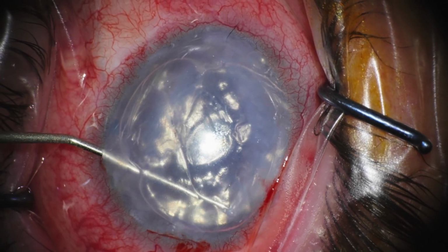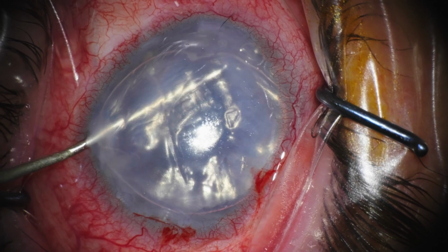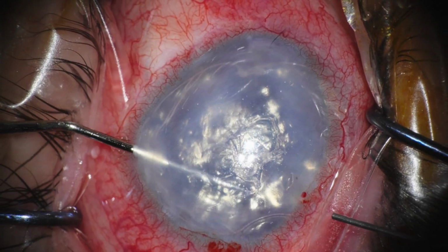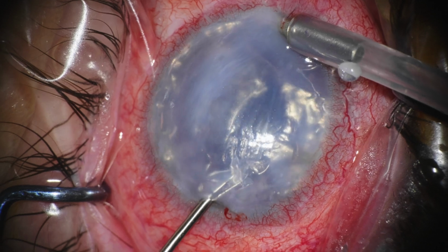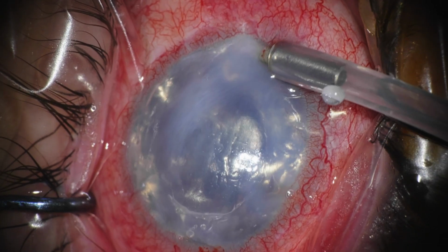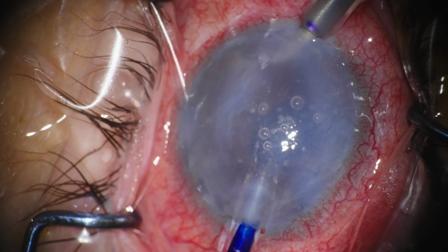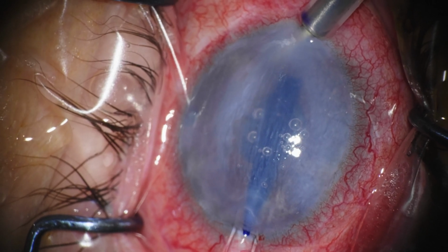One of the anatomical particularities of the case is the reduced scleral rigidity, which makes this eye behave very differently from any of the usual eyes we have. So congenital glaucoma cases have a reduced scleral rigidity, which makes the AC want to collapse upon itself, even though the patient is under IV mannitol. He has an IOL instead of his natural lens, and he's highly myopic with a very big white to white and a very big AC. But still, you would expect his AC to be deep during the stripping and during the graft implantation, but no, it always wants to collapse.